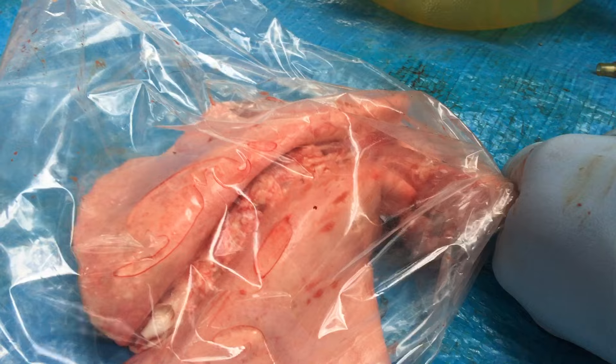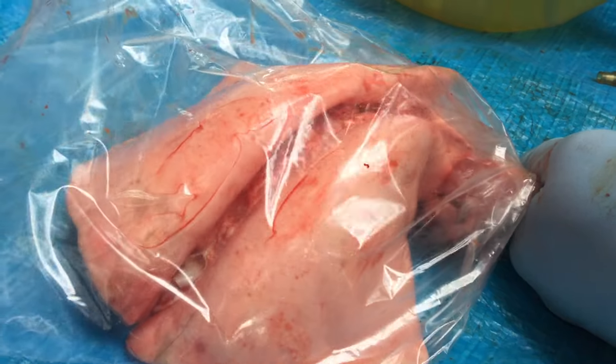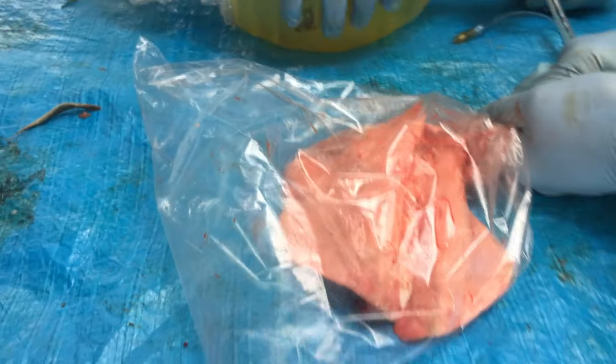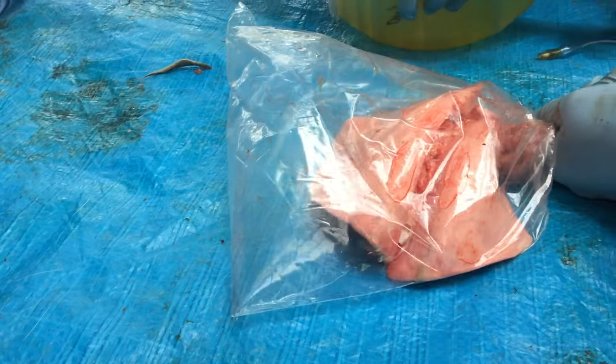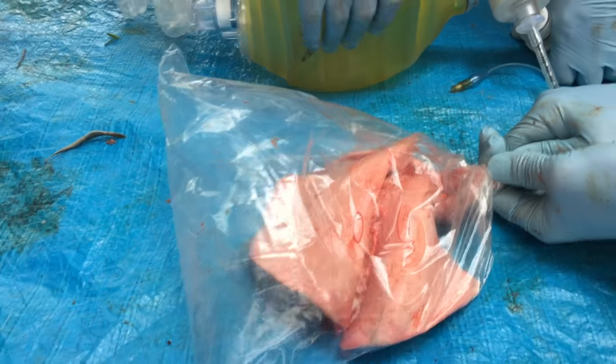We're bagging a bit faster than we normally would. But as you can see, the air is escaping from the lungs and into the pleura, and little by little the bag is getting filled more and more.